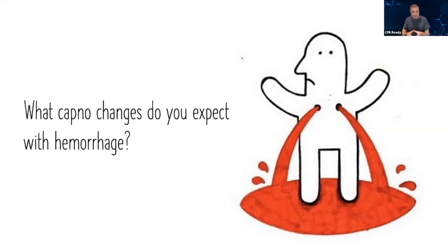So think about it. If they're losing blood volume, that means there's not enough blood to circulate to meet their body's needs. And what did we say? How is CO2 produced? It's produced through adequate perfusion. So the lower the perfusion, the less CO2 gets produced. And your capno, assuming that there isn't a disturbance to your ventilations, with normal tidal volume, normal breathing, the capno will be low if someone is having severe hemorrhage and they have low perfusion.